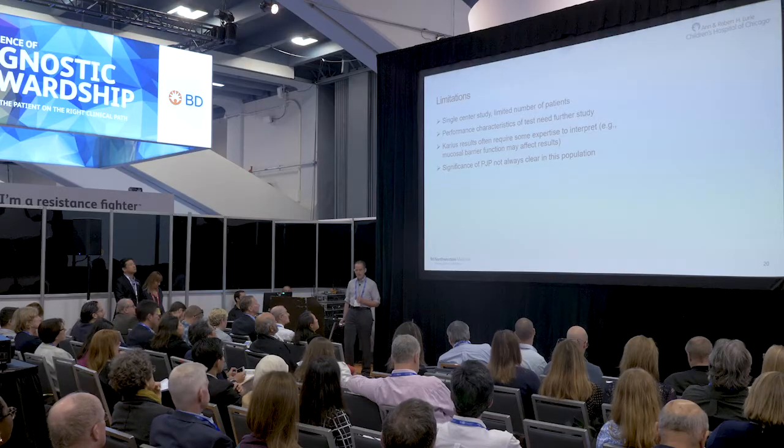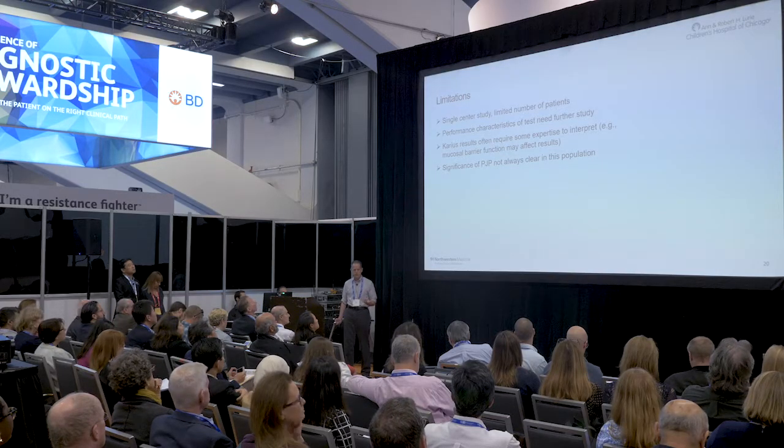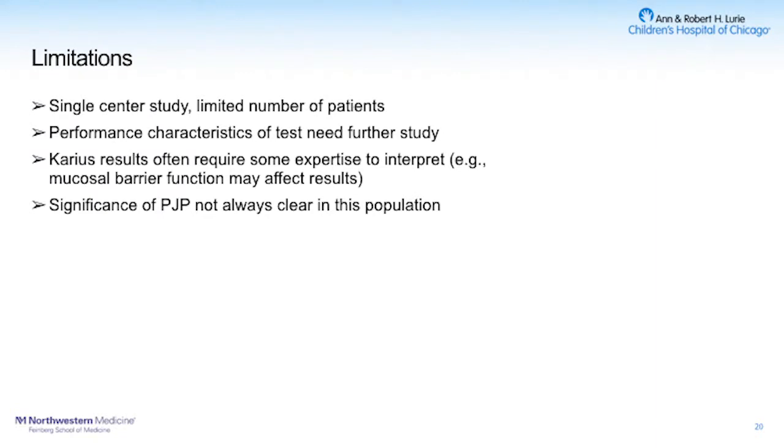Obviously, there are limitations to any single center study. There's only a limited number of patients. We can't draw firm conclusions about performance characteristics like sensitivity, specificity, positive and negative predictive value with such a small sample. But we hope that this provides data to suggest that such studies would be possible and would be welcome to try to improve the diagnosis of these patients using this test.